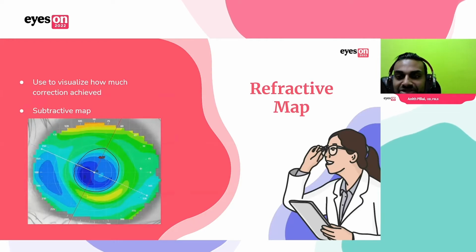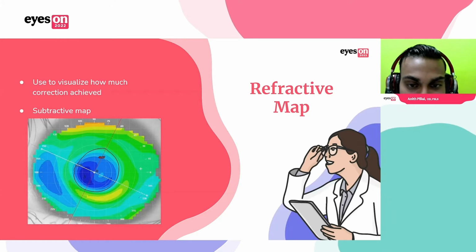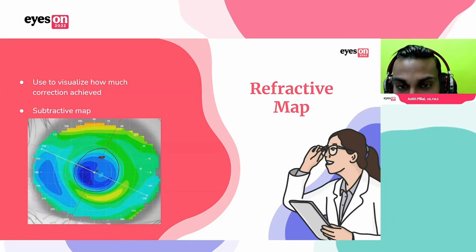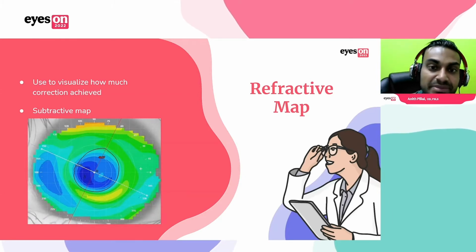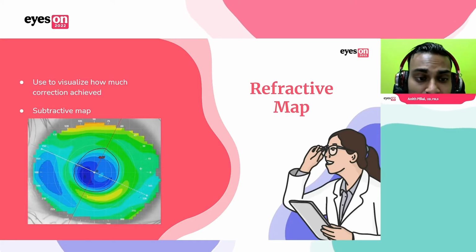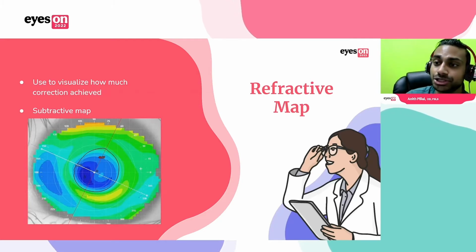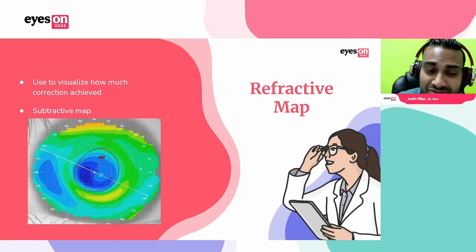The refractive map is very similar to the axial map. It shows the treatment zone, and it shows the amount of myopia you've corrected, or hyperopia. So this is a good objective finding to have. A lot of these patients are going to be young kids, and manifest refractions may not be very accurate. Certainly can get out your retinoscope and get accurate results that way, but having a topography that shows the amount of refractive correction you've done on the cornea can be very valuable.